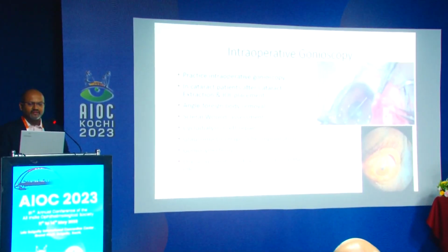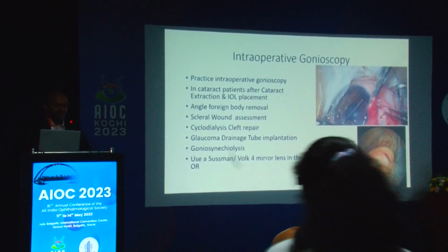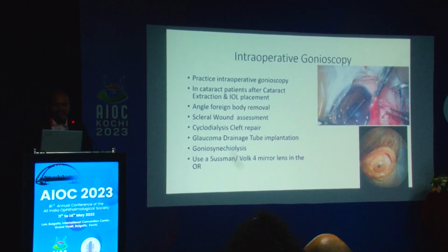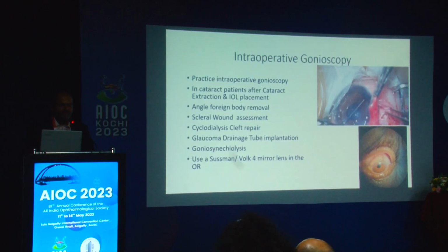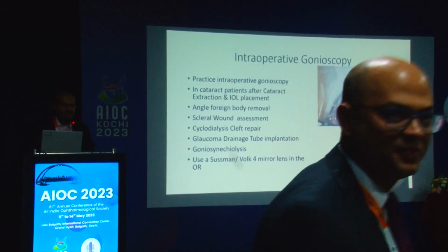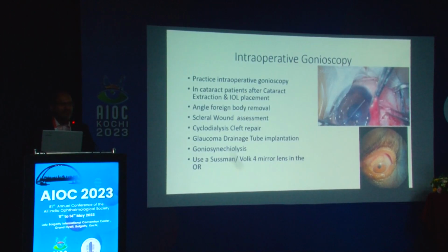As Dr. Mahesh has mentioned, there are numerous ways you could practice intraoperative gonioscopy. Of course, you have to do gonioscopy in the outpatient department, that's a given, but in the operating room you should practice intraoperative gonioscopy. There are a lot of opportunities, especially when you remove an angle foreign body or when you want to assess a scleral wound. For example, in the lower image you have fish mouthing of the SICS section, so you want to see what is happening inside. You do that in the operating room as well as in the OPD.